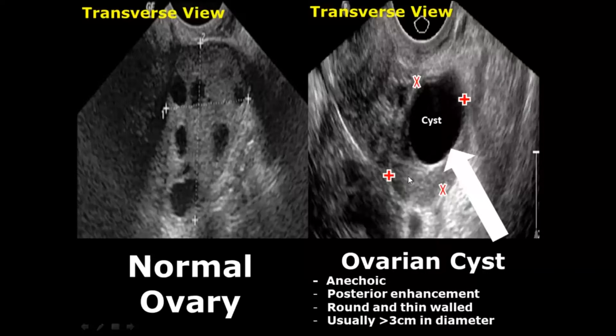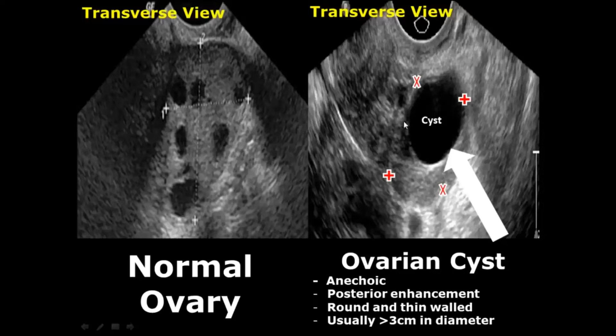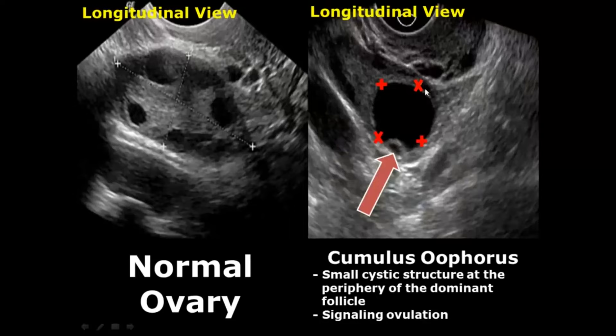Starting with the first case — ovarian cysts: these are anechoic, rounded, thin-walled with posterior enhancement, and usually more than 3 centimeters in diameter. The cumulus oophorus is a small cystic structure at the periphery of the dominant follicle and is a sign of ovulation.